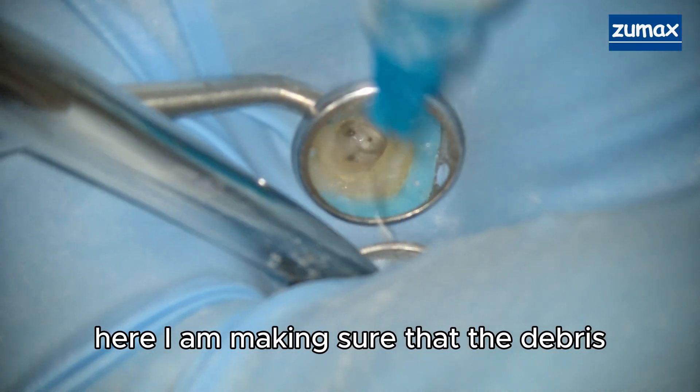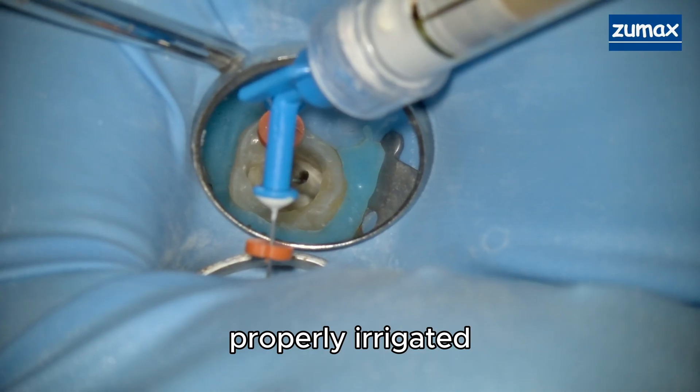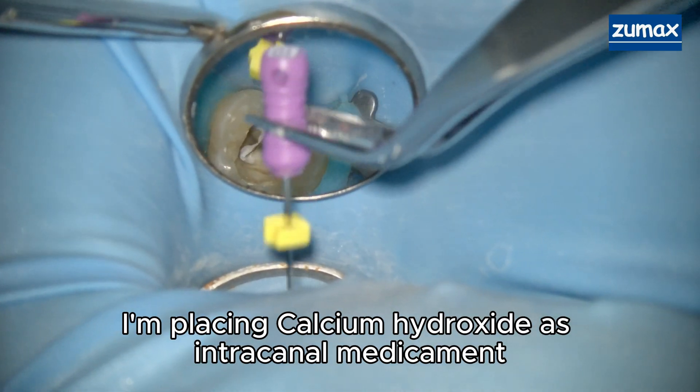Here I am making sure that the debris that builds up during instrumentation is properly irrigated. That was the end of the first appointment, so here I'm placing calcium hydroxide as an intracanal medicament.